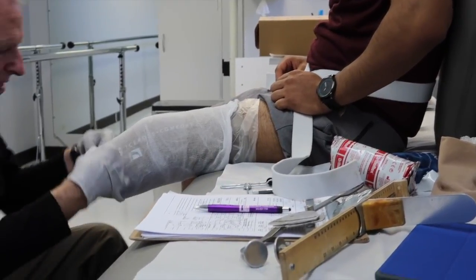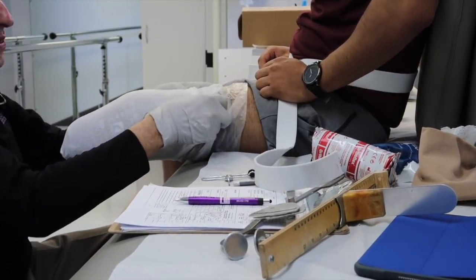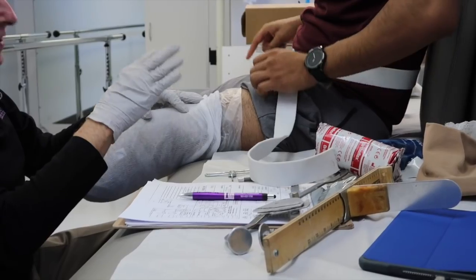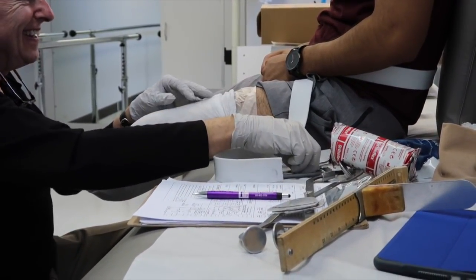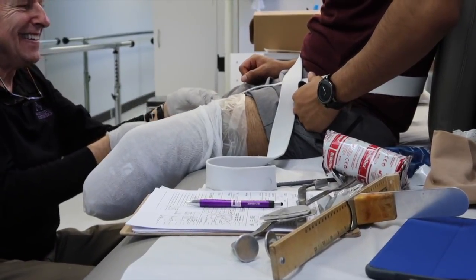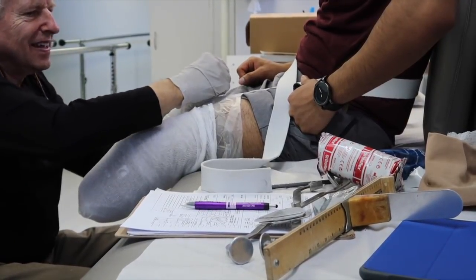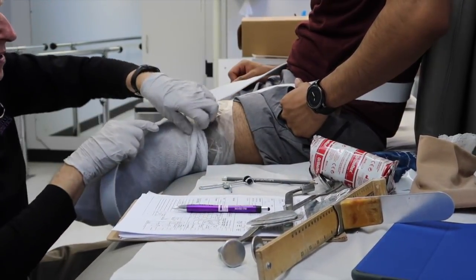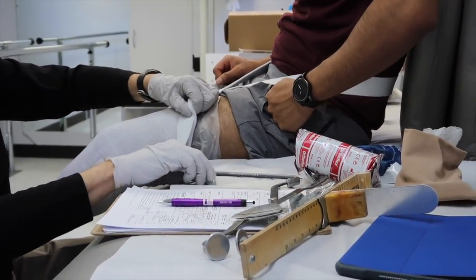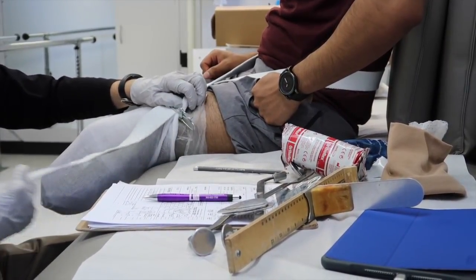Right there he is using a stretchy bandage to kind of create a net around my leg, around my stump. That way he can draw on it — he's gonna draw all the components: my knee, my patella, my tendons, everything. You guys will get to see that. He has to secure that net with a little belt just so it doesn't move, because that's gonna transfer to the cast that he's gonna be putting on me.